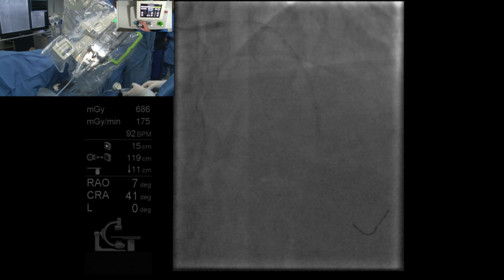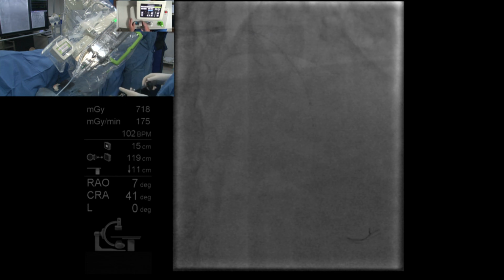Six, okay, 8 down. Balloon up. 6, 8. Down. With the balloon up, I'm just going to push on the balloon. That's going to kick my guide out a little bit. I'll do one more inflation here. Take that balloon up. 6, 8. That's just nosed into the lesion.